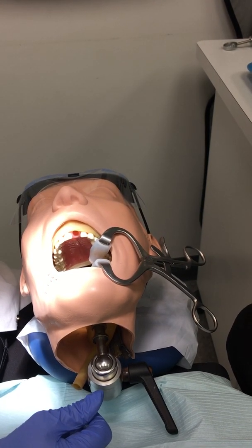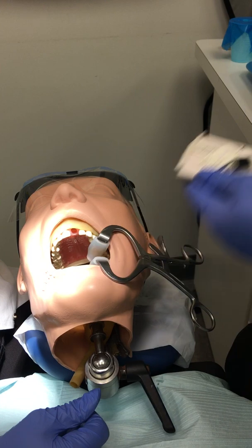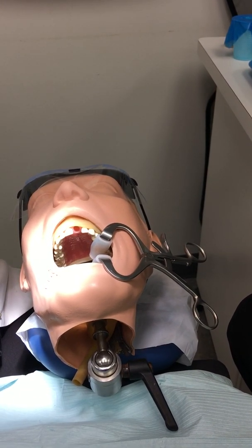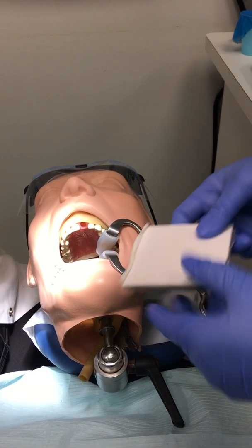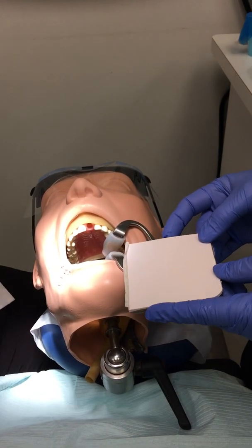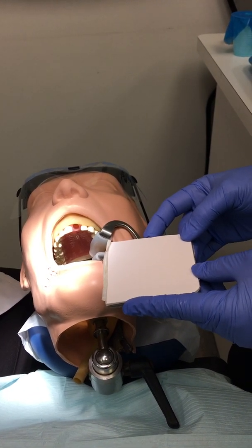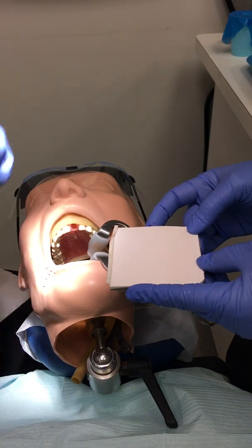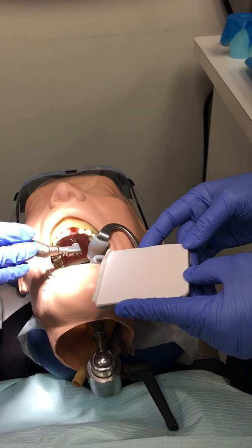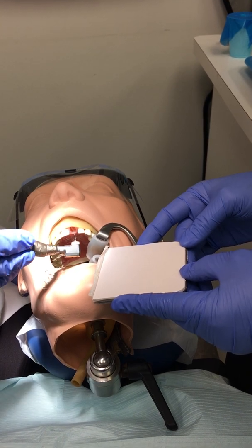Mix your sealer and get out your extra accessory gutta-percha points to fill each canal on a multi-rooted tooth. Pass the doctor the lentulo spiral so he can place it in the contra-angle while you mix the sealer material. Once mixed, place the paper pad next to the patient's chin so the doctor can get more if desired. The lentulo helps sling the sealer on the walls of the canal, and the sealer is used to prevent micro-leakage.